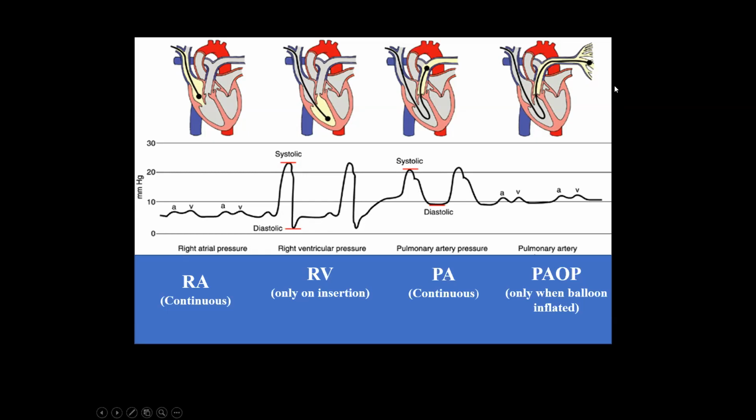Never, ever, ever leave the balloon inflated. You will infarct the lung. So never, ever leave the balloon inflated. You let that balloon come back.